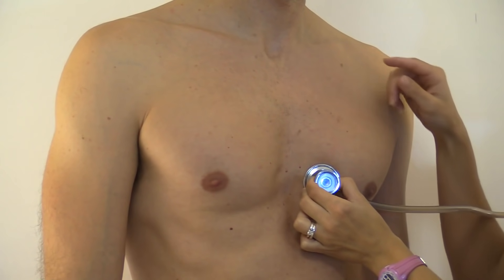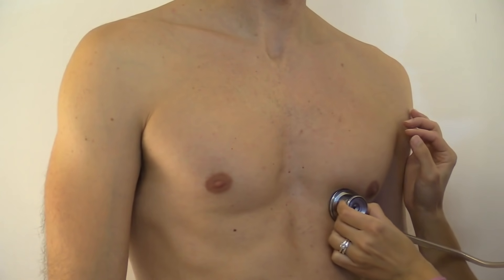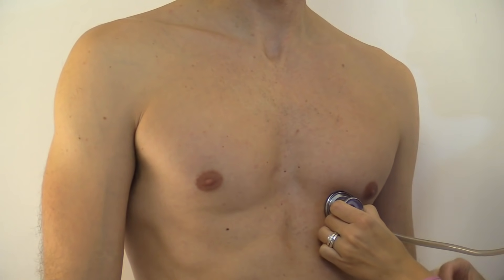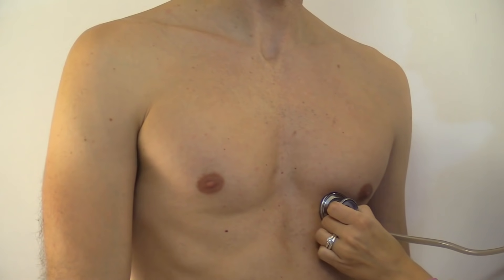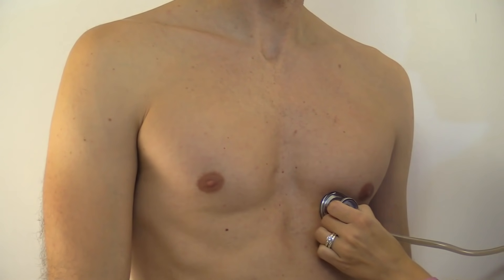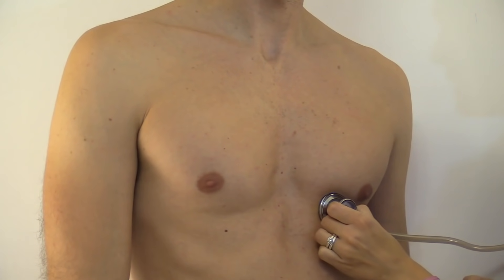Then we're going to go to the fifth intercostal space, mid-clavicular line, and listen to the mitral valve. S1 is going to be the loudest here. This is the point of maximal impulse — where you listen for the apical pulse. We set the stethoscope here and count for one full minute. A normal apical pulse in an adult should be 60 to 100 beats per minute, and his apical pulse was 63.